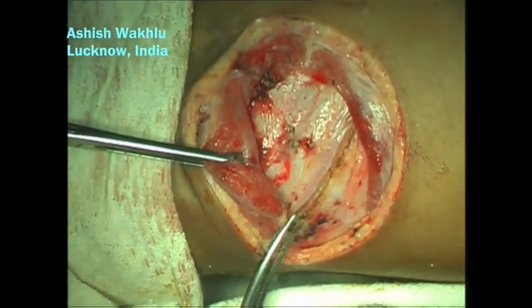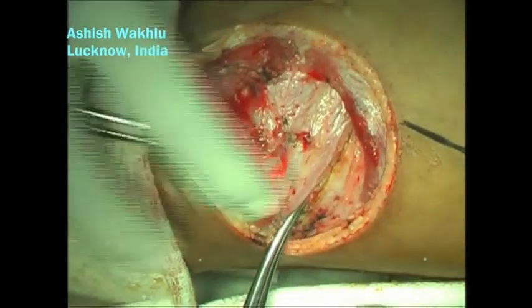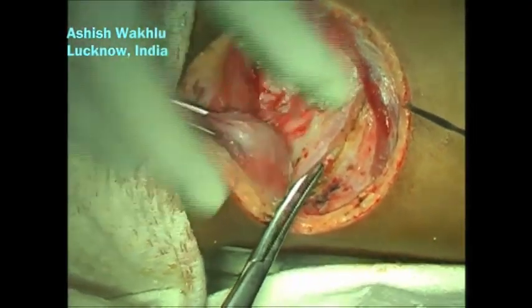Due to the lung being non-aerated on the right side, the ribs are set pretty close together and the intercostal spaces are quite narrow.